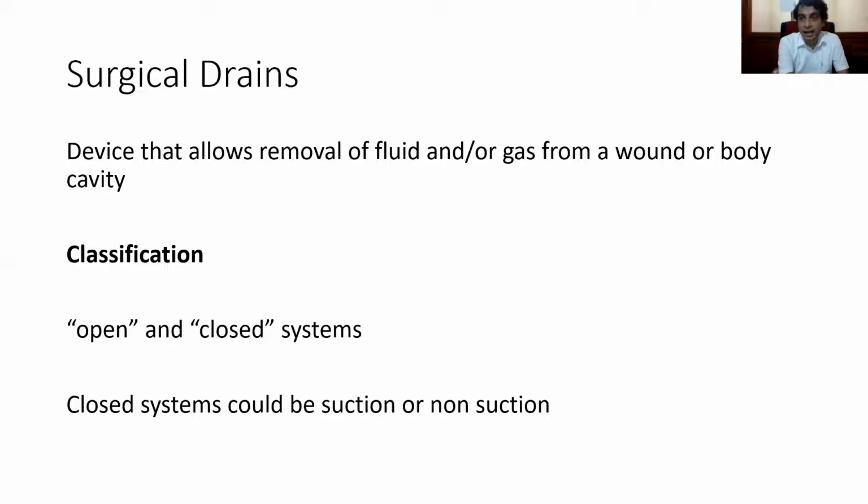Sometimes the patient can't pass urine, so they need to have a drain inserted into the bladder to drain the urine out. Sometimes we have done a surgery, we are worried about bleeding afterwards, so we put a drain in. Sometimes the patient can pass urine, but we want to measure the urine output very accurately, right? So sometimes we might put a drain in just to make sure that the input and output of the patient can be assessed properly, to check whether the patient is well balanced, dehydrated, things like that. So there are many reasons for inserting drains. One of the bits of assignments that you have is to make a list of reasons that we have to insert drains.